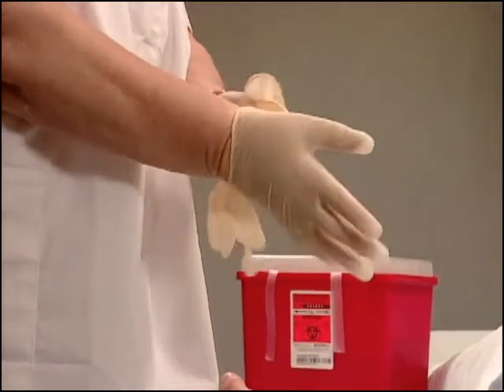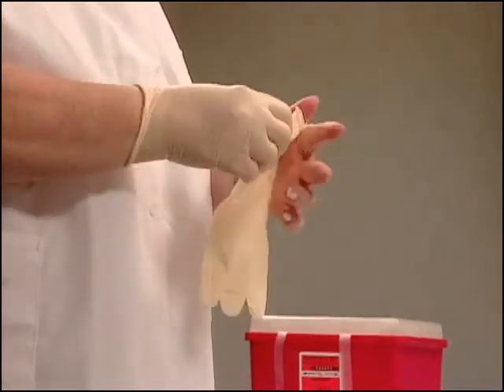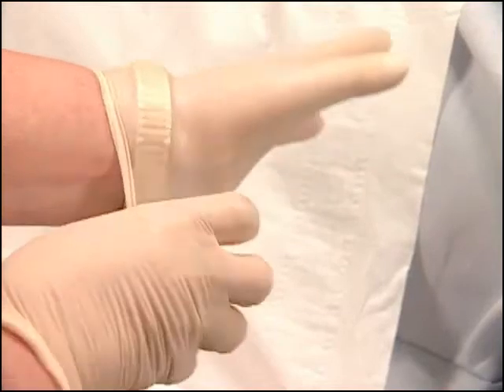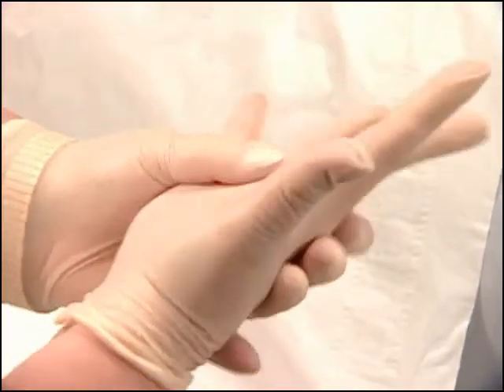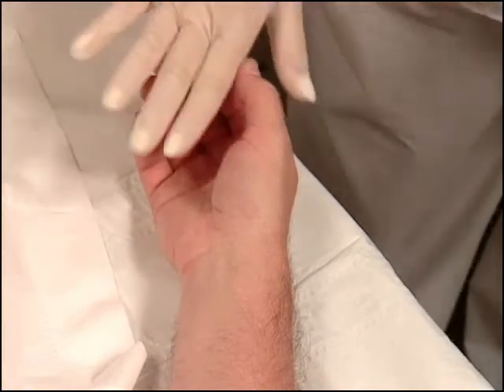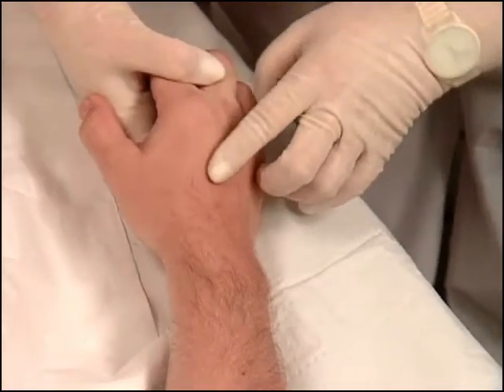Don your gloves. Make sure they fit snugly, and inspect them for tears and holes. Never tear off or remove any part of the gloves while you are wearing them. Begin the procedure by asking to view the patient's arm to check for the patient ID band.